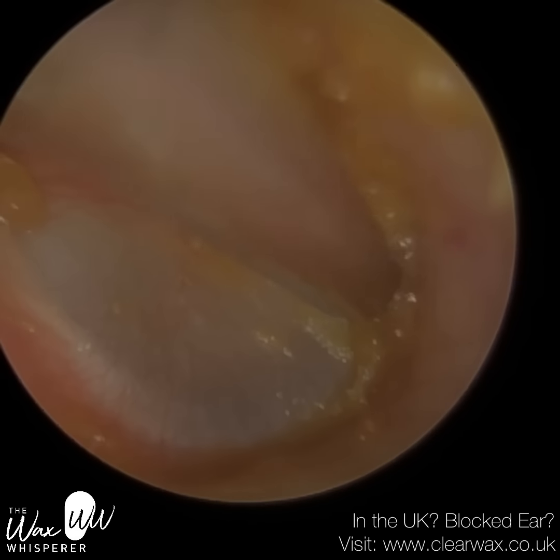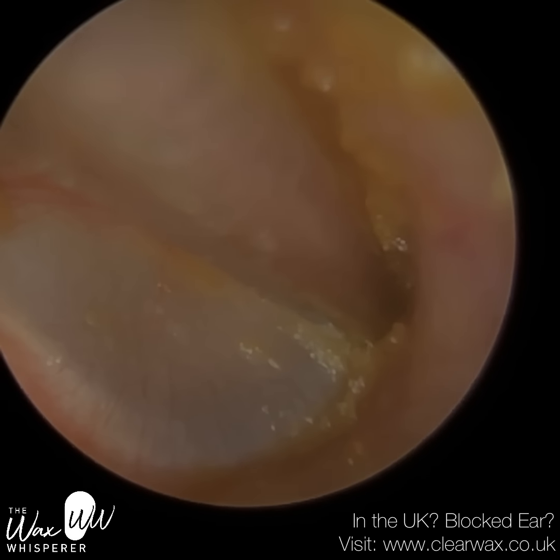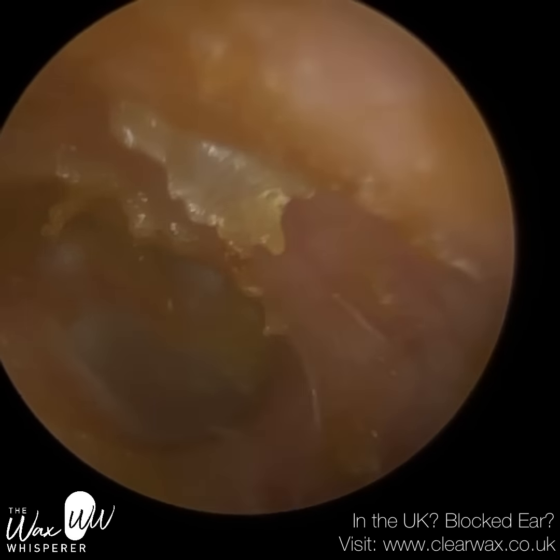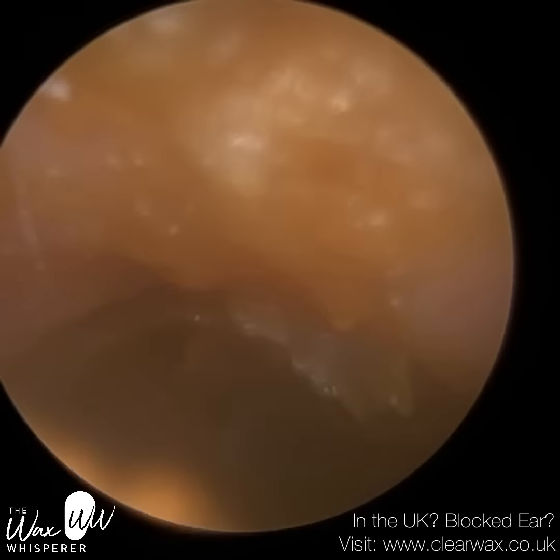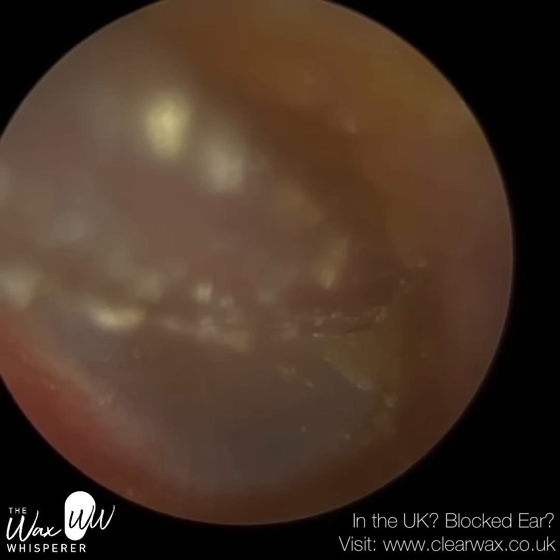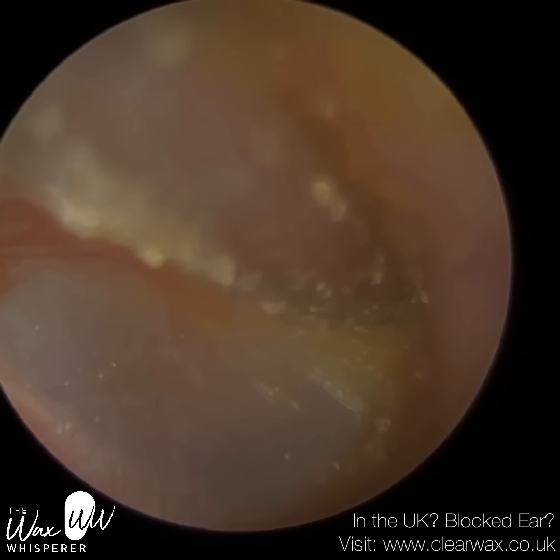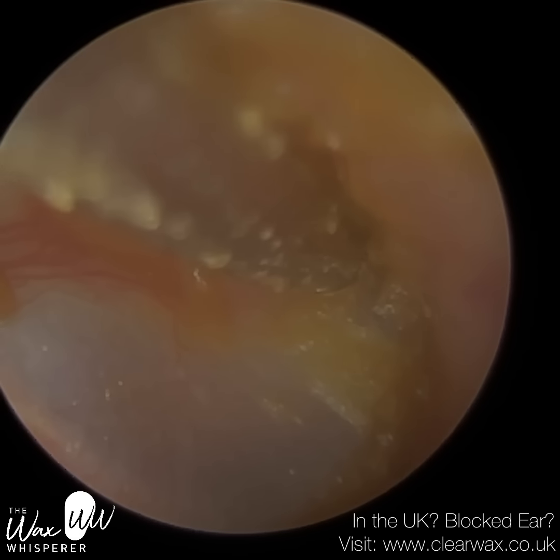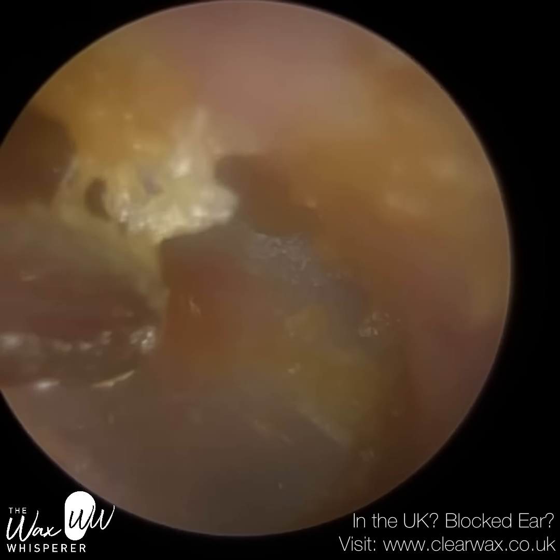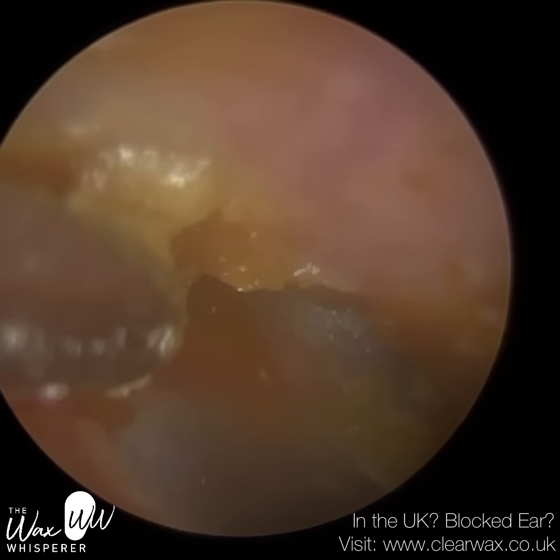A technique we can use is to attach a fine, narrower suction tube to the end and slightly bend the tip, which can then be used to curl around the anterior canal wall. We've got good space and headroom so we're not going to make contact. This is the anterior recess — the hidden cave, the alcove to the front part of the eardrum. In the case of the right ear this is on the right-hand side. I've just bent the tip ever so slightly, giving a bit of curvature, and that helps me to get curled around the anterior canal wall. I'm now just kissing the surface of the eardrum and you can see it's slowly coming away.